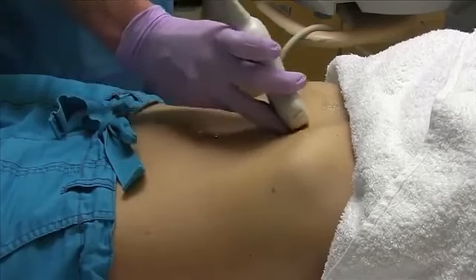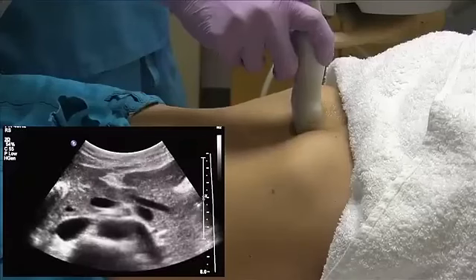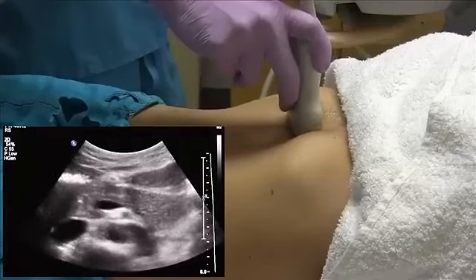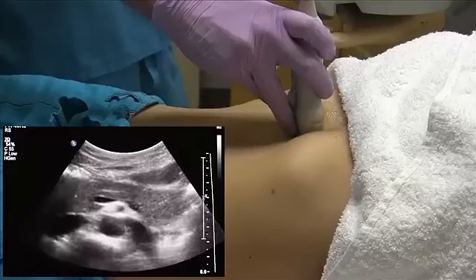The other key is you want to oblique your transducer slightly counterclockwise. This will set you up for a nice sagittal pancreas image.